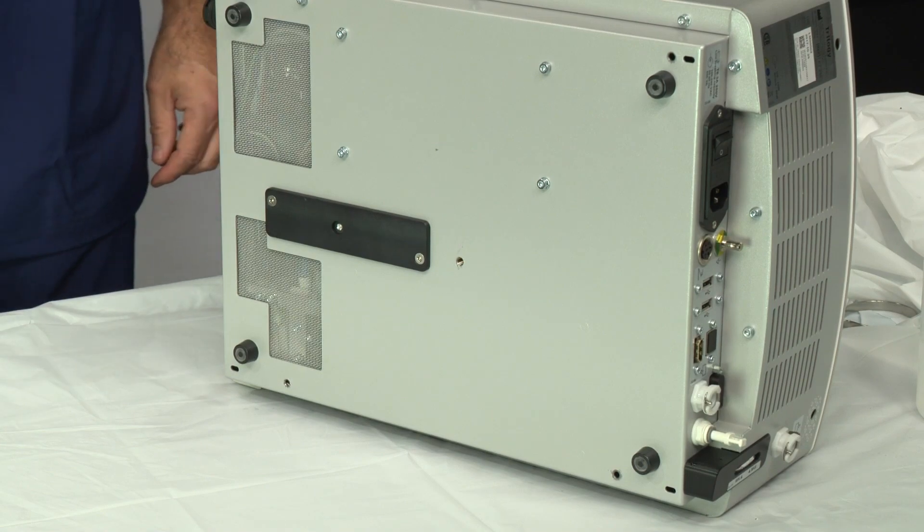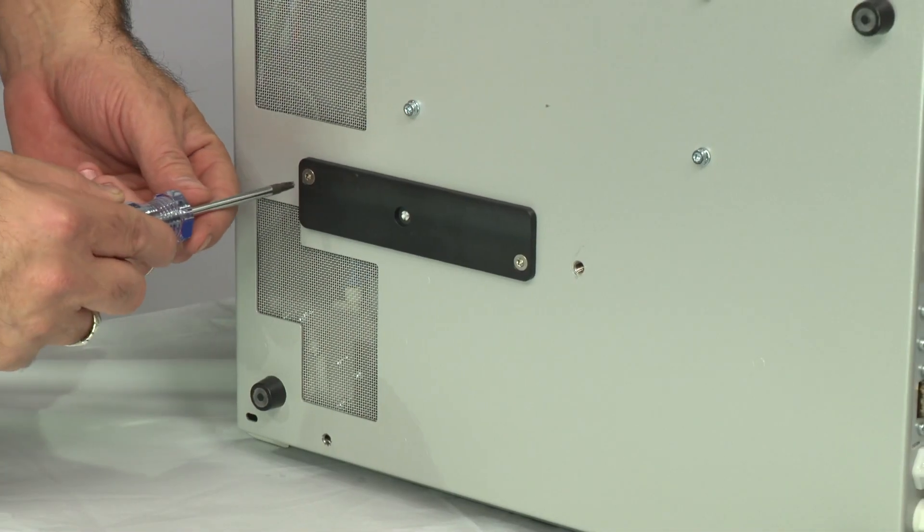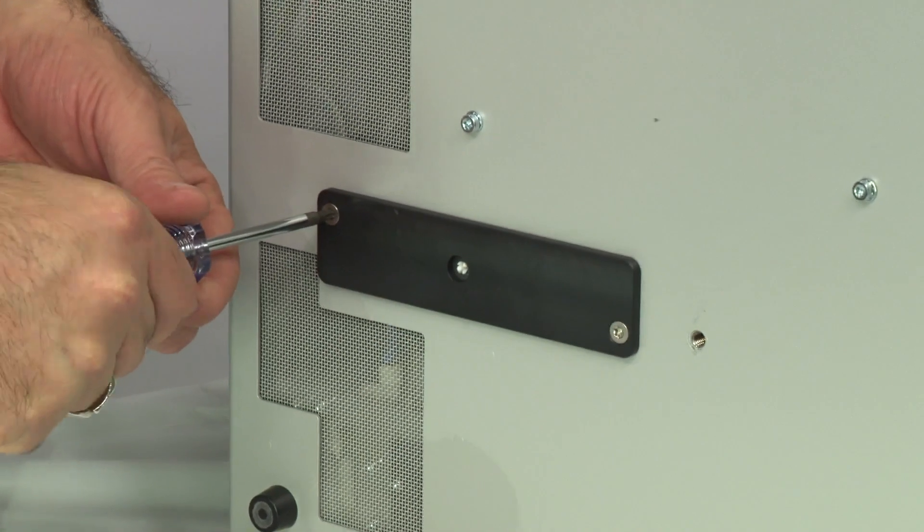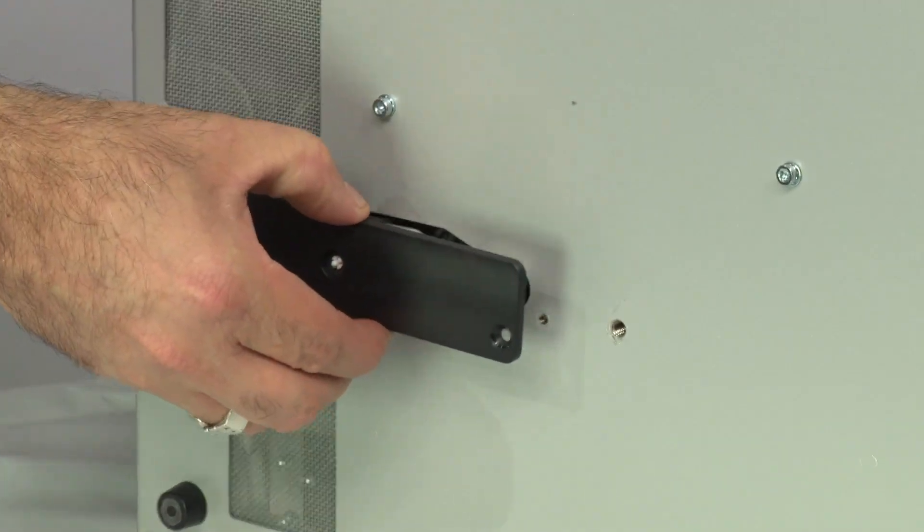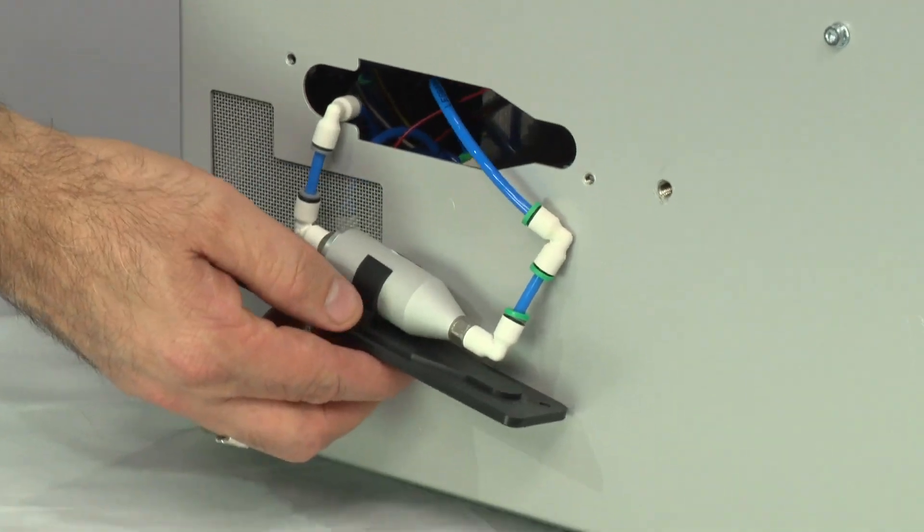Place the console flat on its side. Use the Torx tool size 20 to remove the water filter cover. Carefully remove the cover and water filter from inside the Trilogy console.